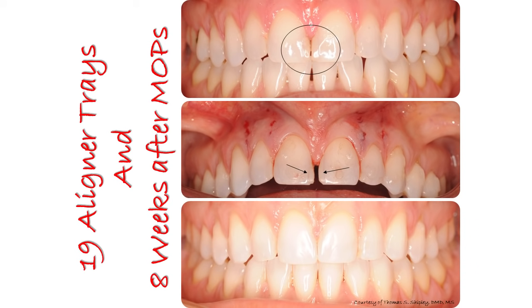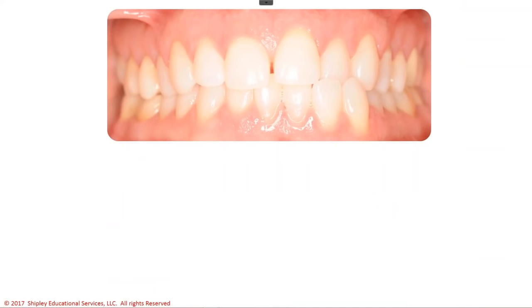In fact, I've never seen resorption of the roots in any of my Propel cases, but we're working on 2 research projects to try and prove that. So one is a resident doing a project for me from a more unbiased standpoint, and another project is one that I'm just going to be working on my own, which may have the air of some bias since I'm presenting it myself, but I still want to advance that conversation. But what a great result here we got with 3-day aligner changes.